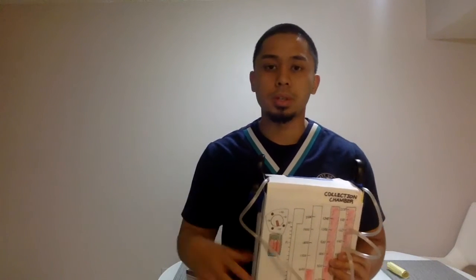Okay, so upon entering the room, we want to make sure that we provide the patient privacy and then let our presence be known. Hi, my name is Brian. I'll be your nurse for today. Today we're going to perform a chest tube drainage. Is that okay with you?